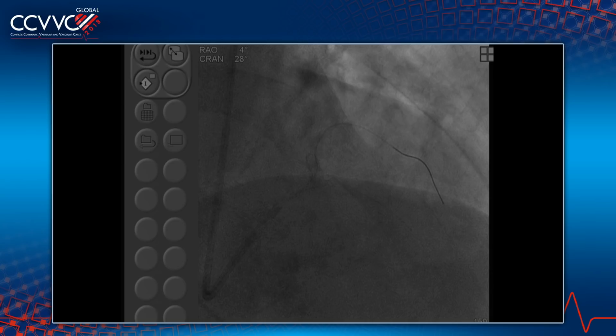So what do you think of the data, Antonio? I don't care about the data. Okay. What do you say, mini crush, TAP? Good point. You're correct. I don't care either anymore.